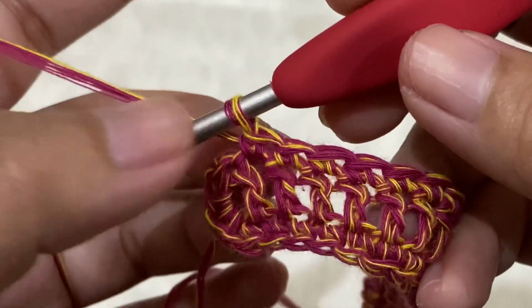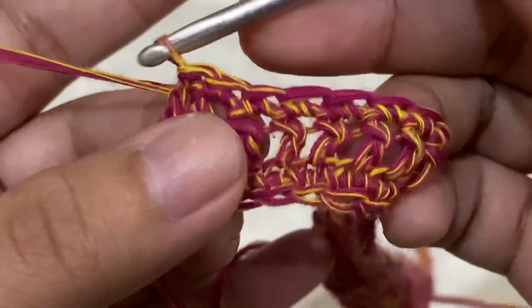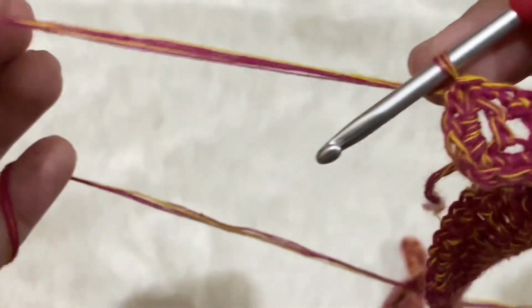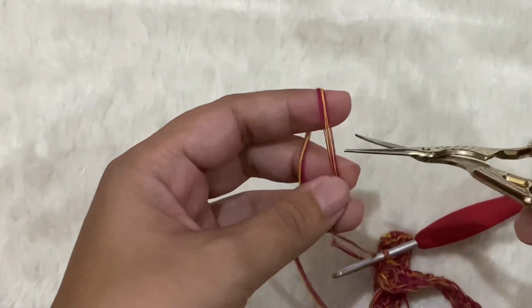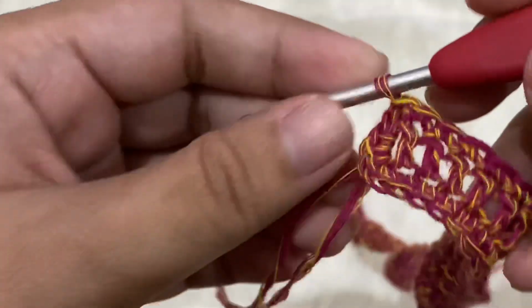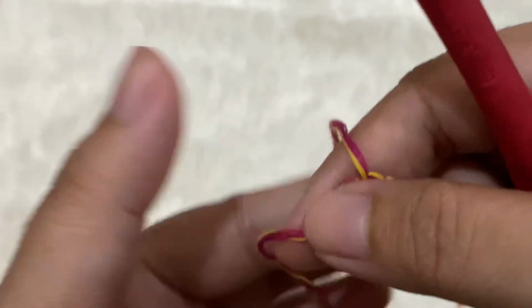Okay, so we're here at the end of the row, so just slip stitch. And then you can cut off the tail right there. I will leave about 3 inches long, and that's the same yarn that I will use to sew the button on. Okay, so right there, just fasten it off like that. So now we have 2 tails, the beginning tail and this one at the end.